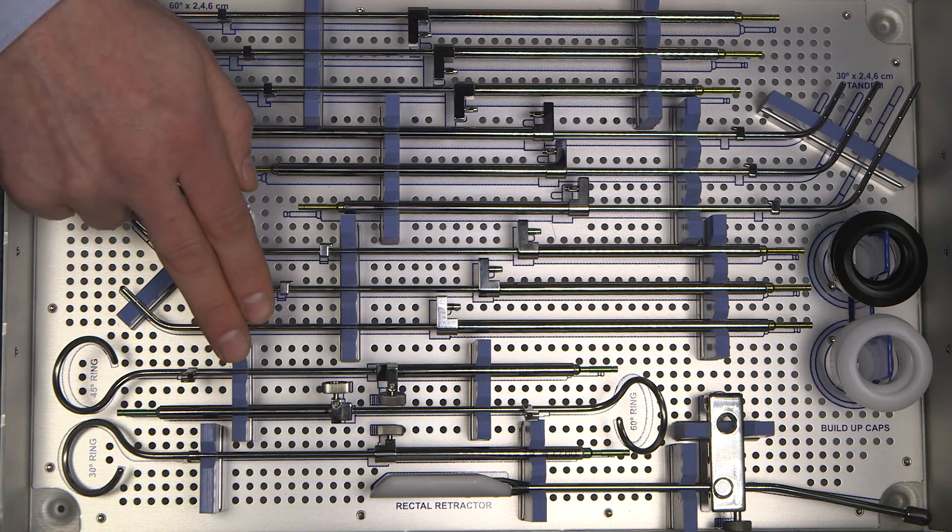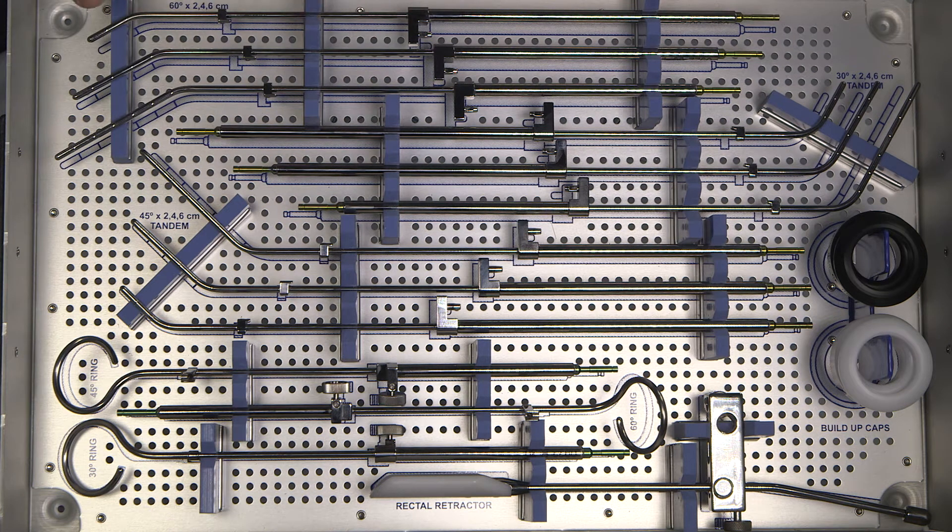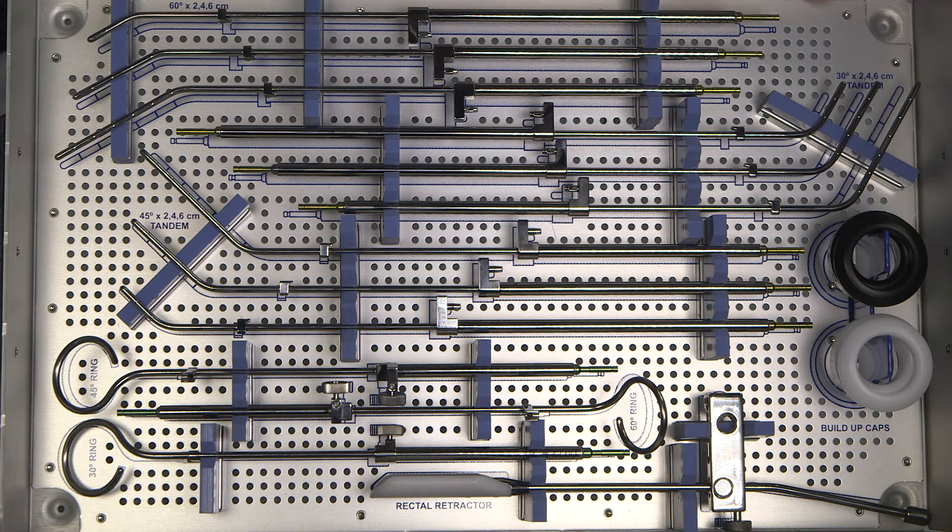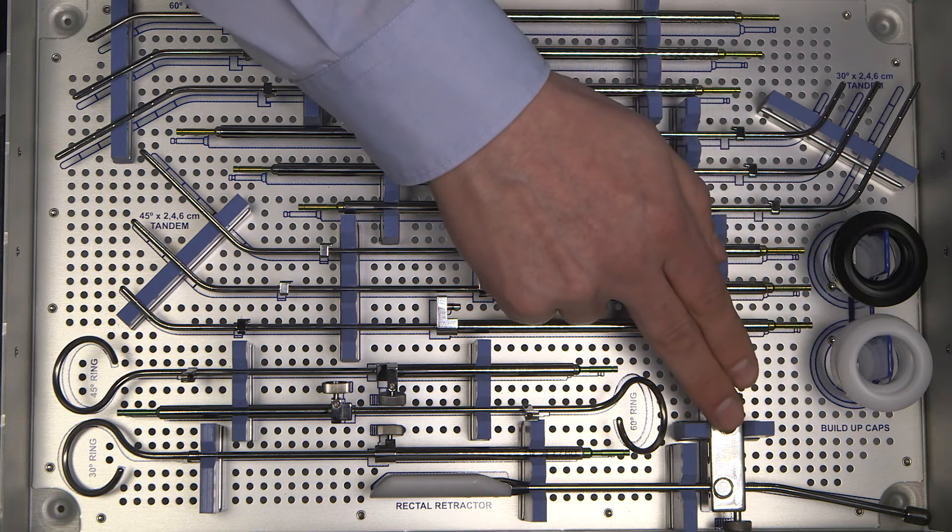The set consists of rings in three different angles together with the corresponding IU tubes that are available in 2, 4, and 6 cm lengths. It contains 5 and 7.5 mm buildup caps and a rectal retractor.